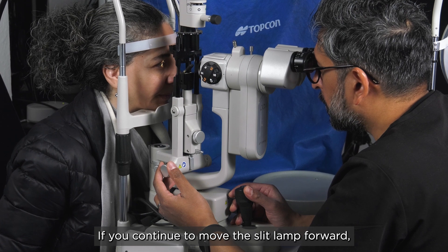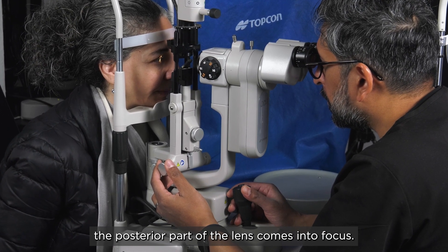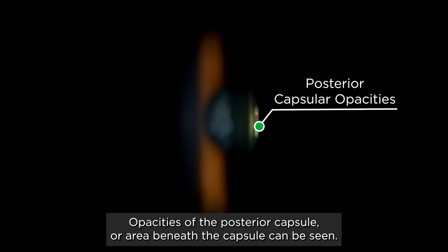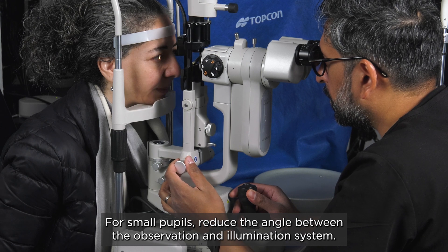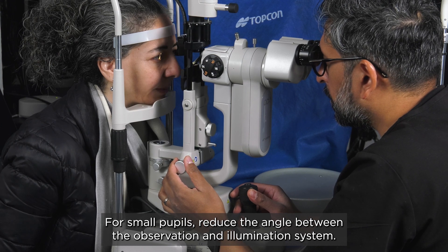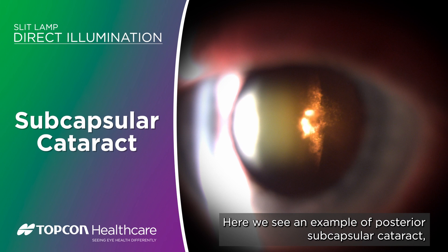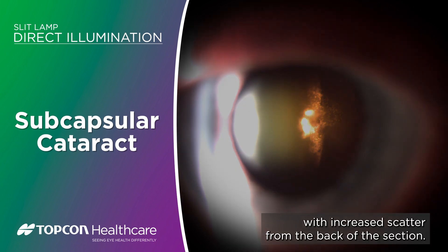If you continue to move the slit lamp forward, the posterior part of the lens comes into focus. Opacities of the posterior capsule or area beneath the capsule can be seen. For small pupils, reduce the angle between the observation and illumination systems. Here we see an example of posterior subcapsular cataract with increased scatter from the back of the section.